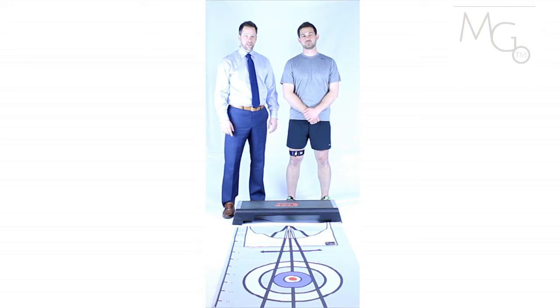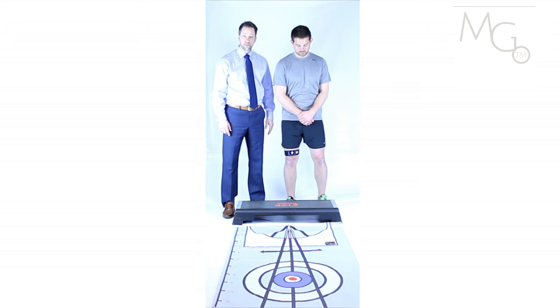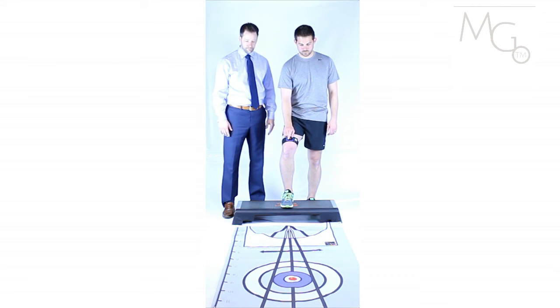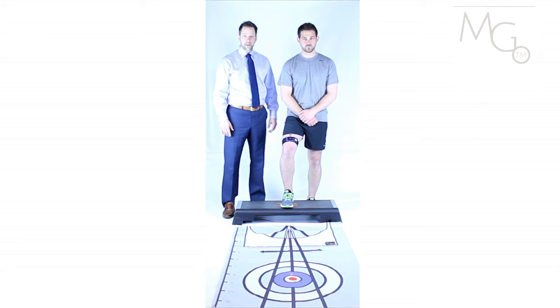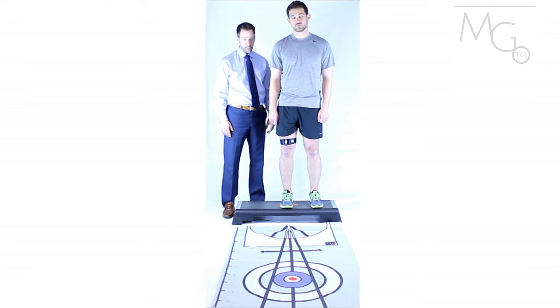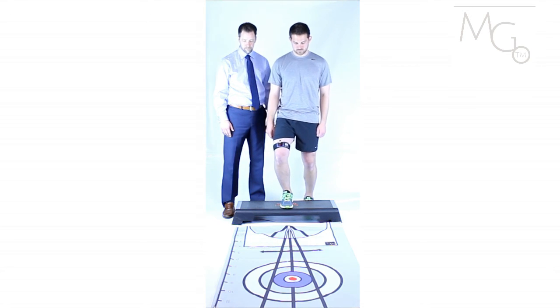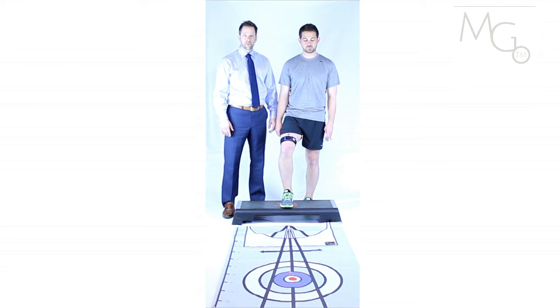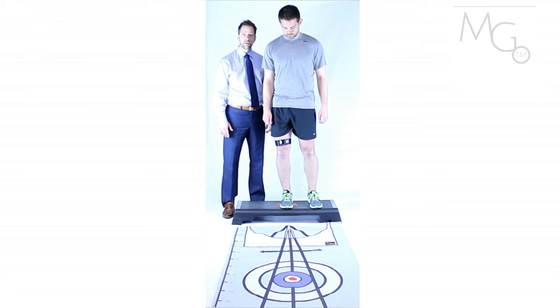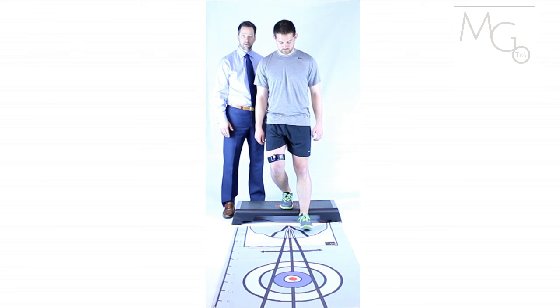A functional application for the Motion Guidance device at the knee is using a step. Once the device has been placed at the knee, the patient can step up with the involved side. The laser will be turned on and placed into the target. Once properly set up, the patient can perform a step up and get immediate visual feedback on actions happening during the exercise. Once appropriate training has been achieved, you can advance this to a step down — the patient steps up and then steps over, still maintaining control of the lower limb.